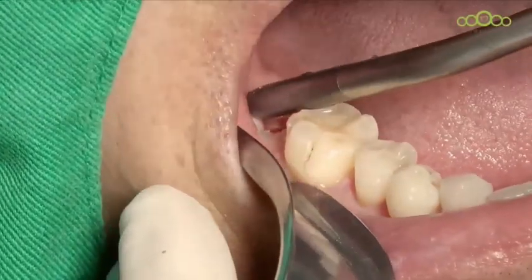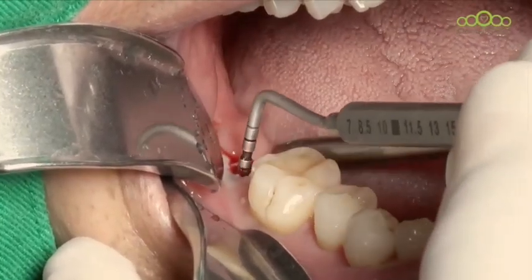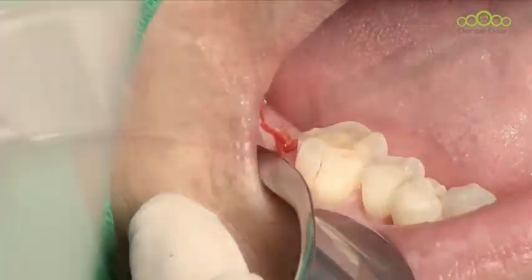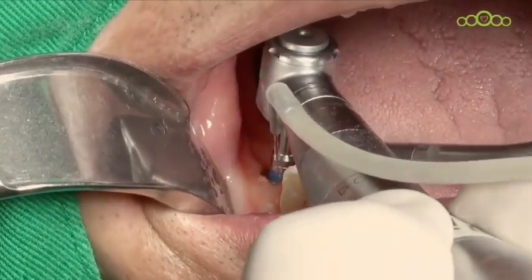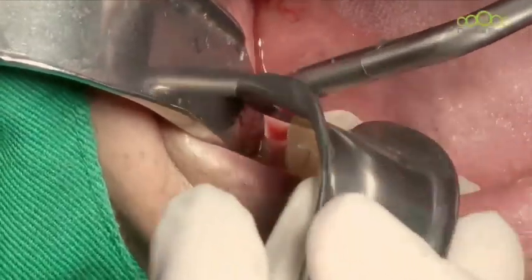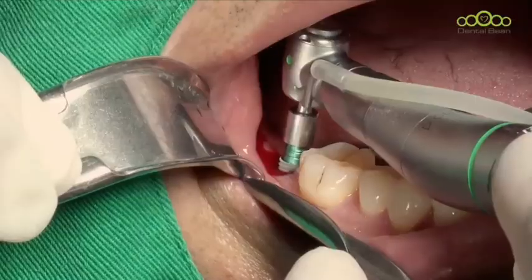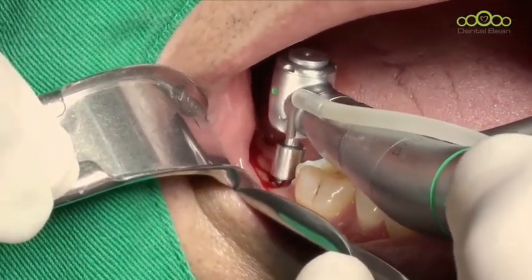There is one question. Okay, early means within 3 months. Early implant means within 3 months. Immediate is within 2 weeks. So 2 weeks to 3 months, it is early implant. I don't like this at that time. Instead, I wait more than 3 months. Okay, this case is more than 3 months after extraction, and I can do simple flapless surgery.